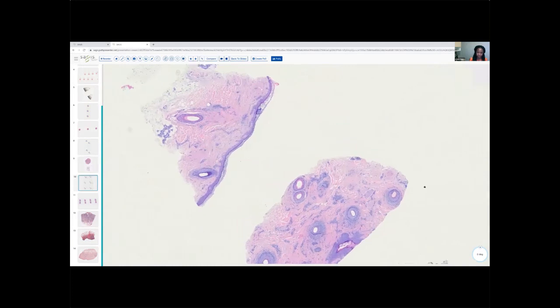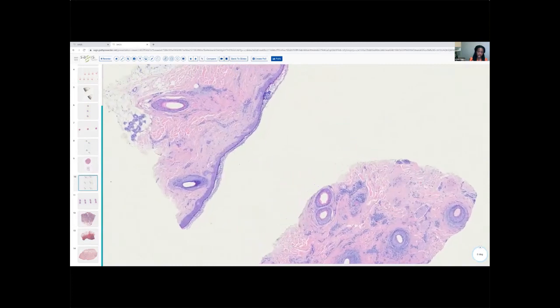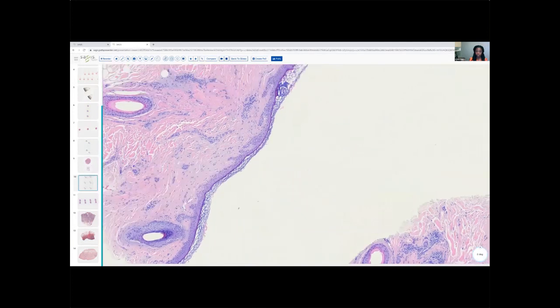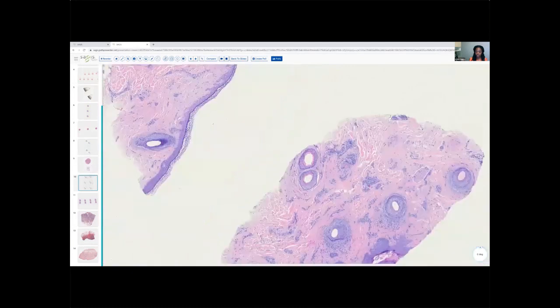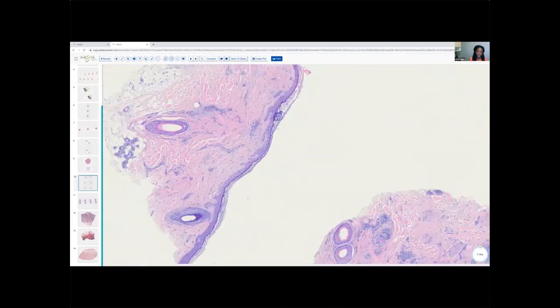And, you know, we don't have that lichenoid infiltrate so much, but we do have some concentric fibrosis that is really very, very striking. So you see the hair follicle and you see that fibrosis that is very concentric. And so that's quite typical of FFA. We can certainly have some interface as well, but that fibrosis, you can just really appreciate that even at low power.